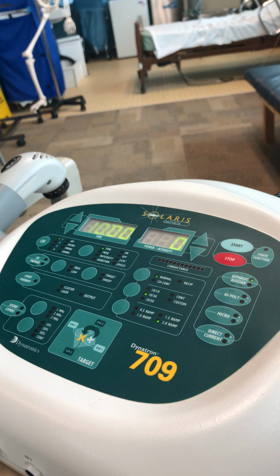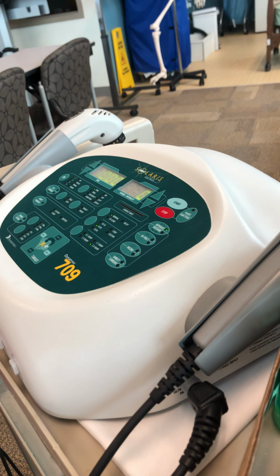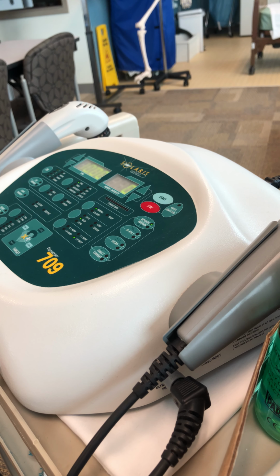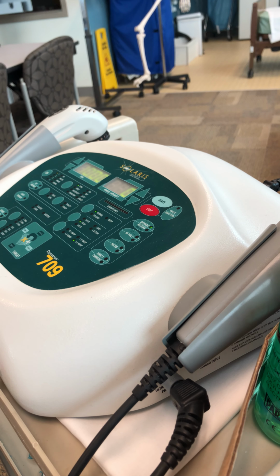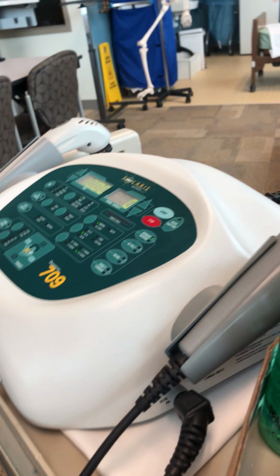All right, so I would still do a skin check. Can you feel me touching you? I'm going to use this one. Yep. Again, I'm making sure she can feel me, because if she can't feel me, then she can't tell me if it's going to be too strong, and to make sure there's no open wounds. Place your pads. Yep, right down there.